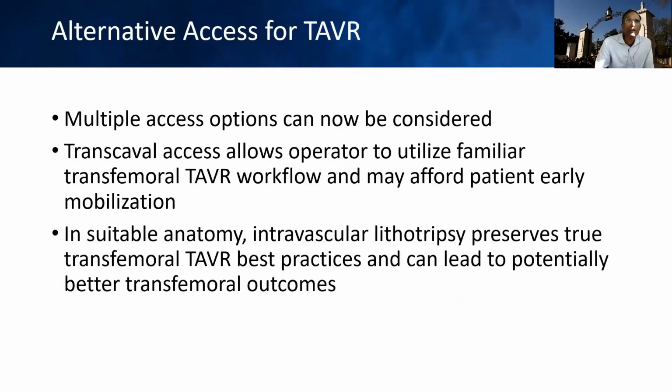So in conclusion, currently in 2020, when we think about alternative access for TAVR as presented for these 2 cases, transcaval and transfemoral facilitated with lithotripsy, our center at Emory feels that these 2 techniques can allow operators to utilize the familiarity of a transfemoral workflow and try to afford early mobilization, potential next day discharge, and the benefits that have been seen in avoiding the risk of non-transfemoral access.